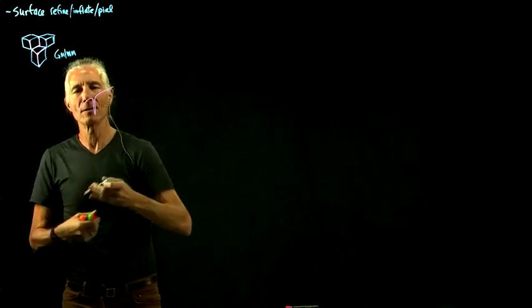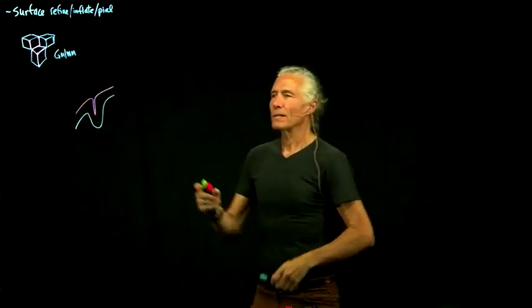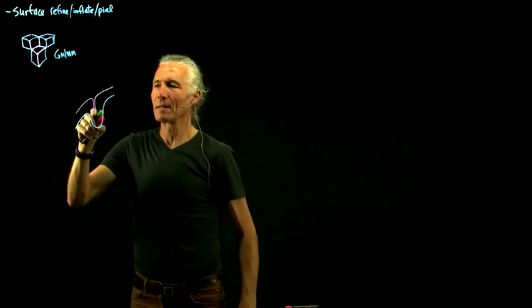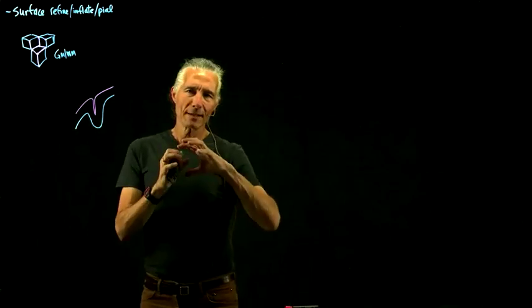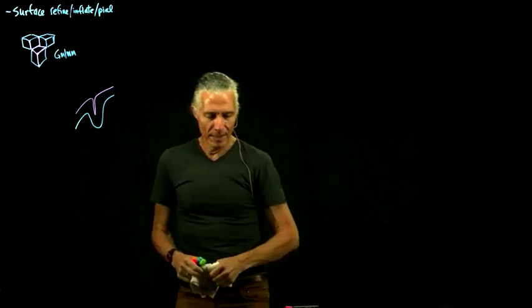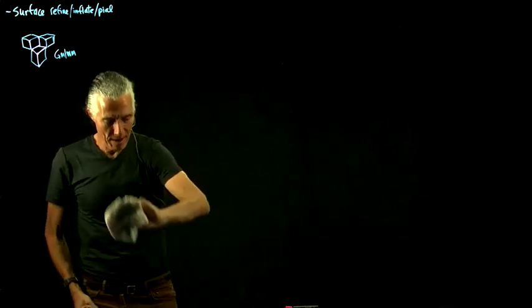So the gray white matter surface is this surface right here, but we could also try to find the pial surface. The pia is the outer layer of the cortex. We could also do other things like try to align brains on the surface, and I'll talk about that on Wednesday. But today what I want to talk about is basically how we refine the surface.